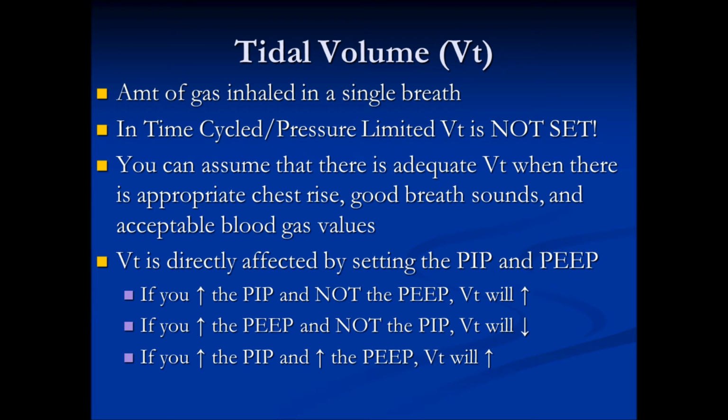As you know, tidal volume is the amount of gas inhaled in a single breath. In time-cycled, pressure-limited ventilation, tidal volume is not set. That should not be new information to you. As you know, if you are setting pressures, you are not setting volume. It doesn't change because you're dealing with the neonate.